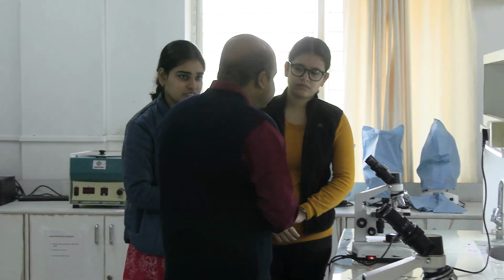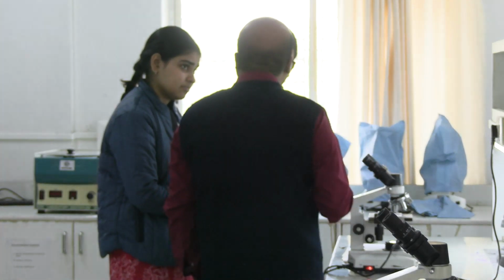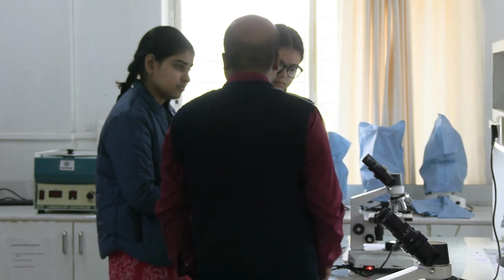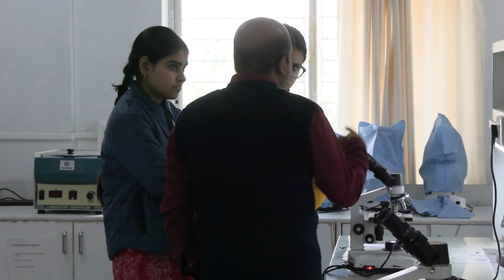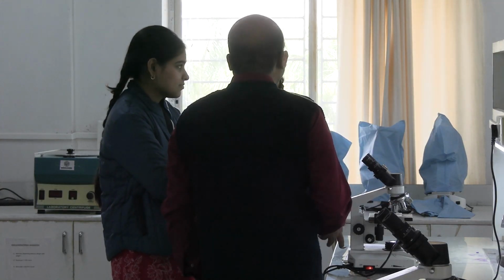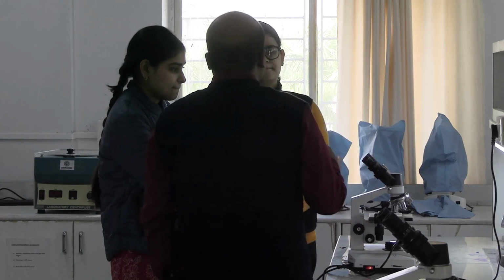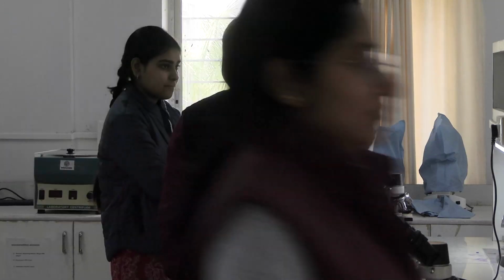At this point, there is nothing to do. If you count these cells considering that the dilution factor is 200, then the counting will be wrong. This is actually less dilution. So one thing you can do is count these cells, see how many there are, and then adjust by back calculation of the dilution factor. Say I have taken blood up to 1 instead of 0.5. If you have taken blood up to 1, it is 100 times dilution.